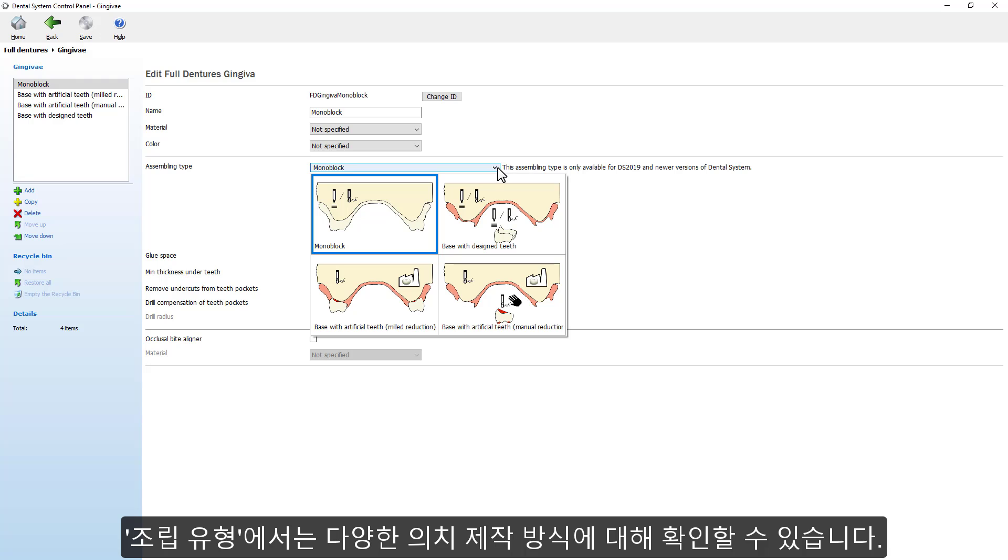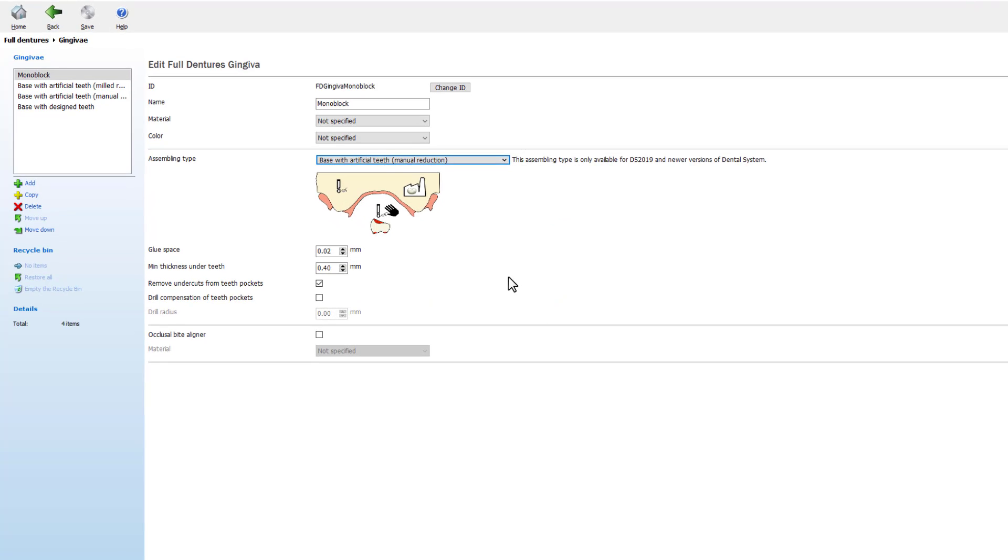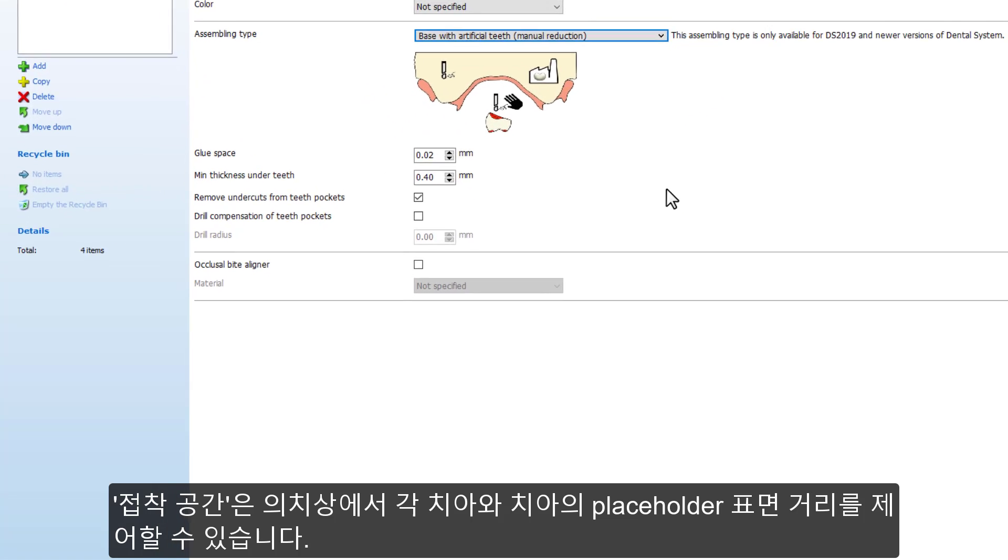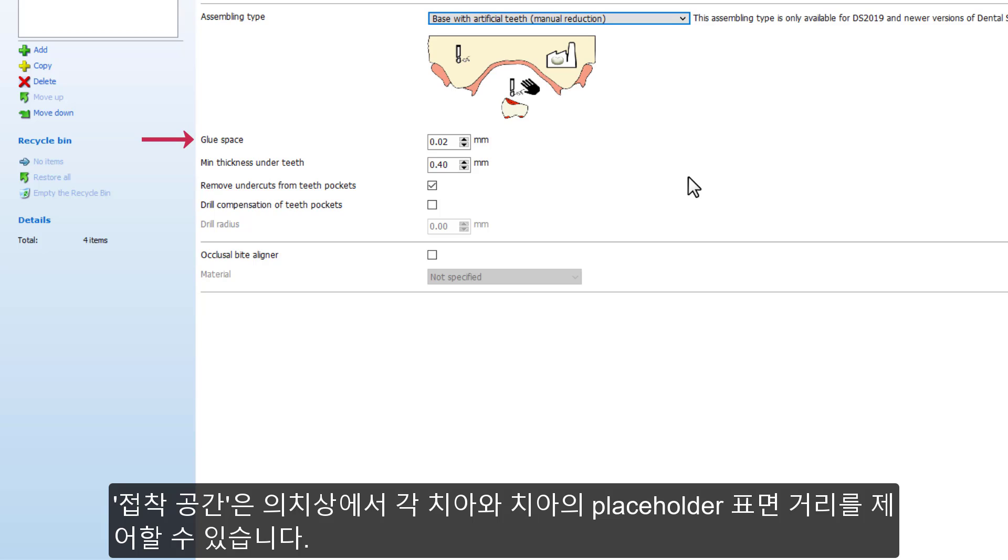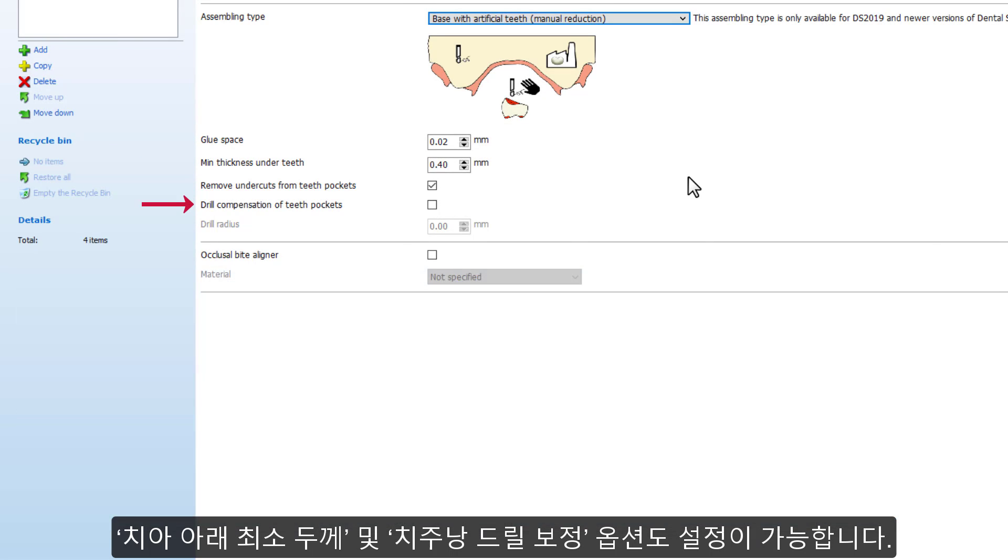Glue Space controls the amount of distance between each tooth and its placeholder surface in the denture base. You can also set the minimal thickness under teeth and the drilling options.